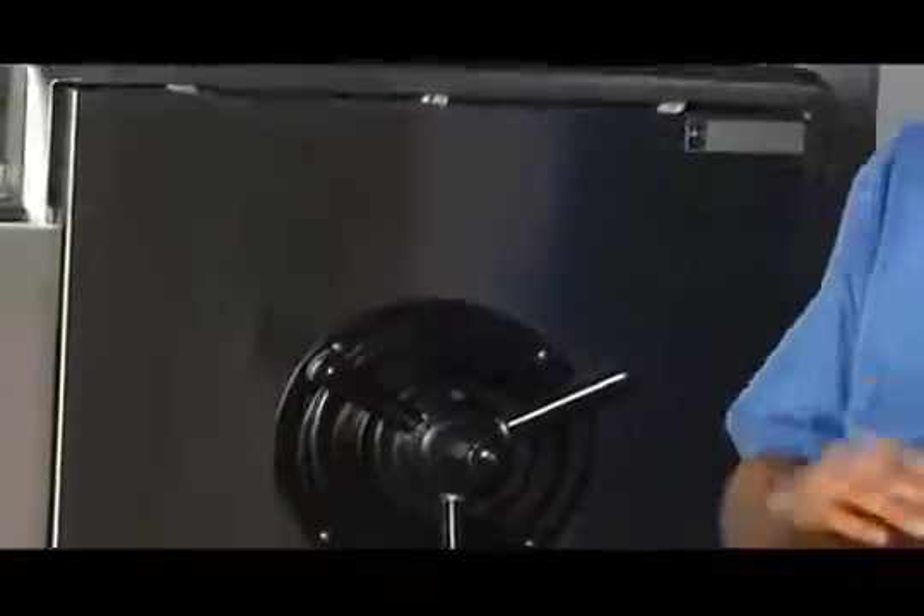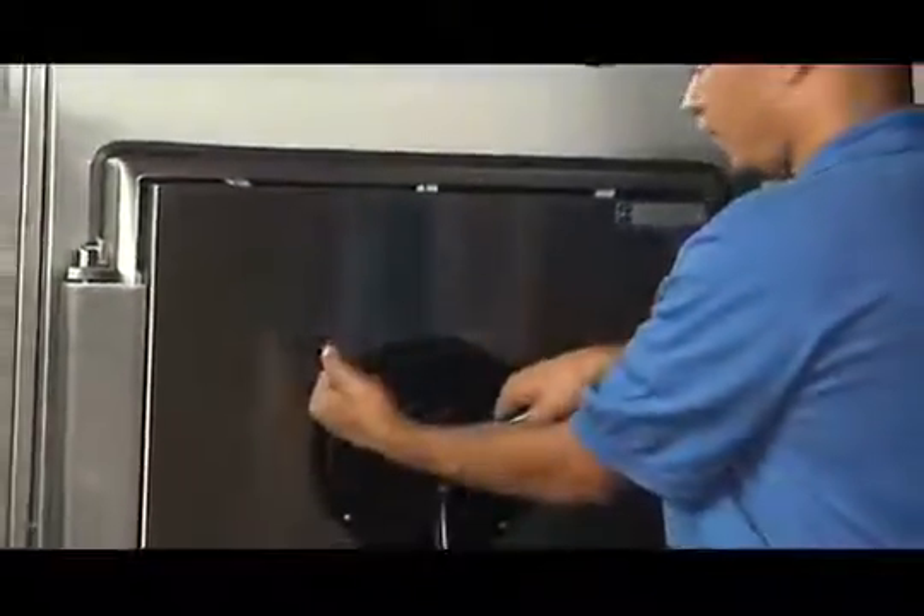To open the door, first turn the handle slightly to the right to disengage the clutch lock mechanism. Failure to do so will cause fatigue to that component and cause it to fail prematurely.